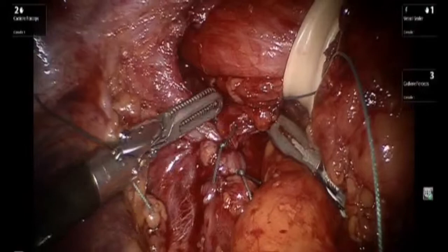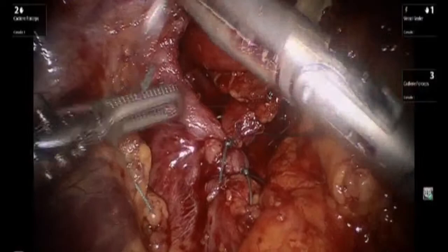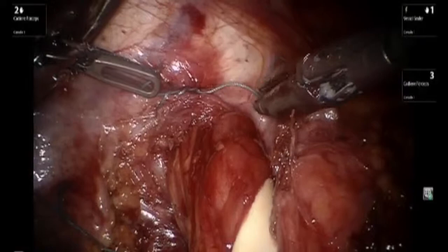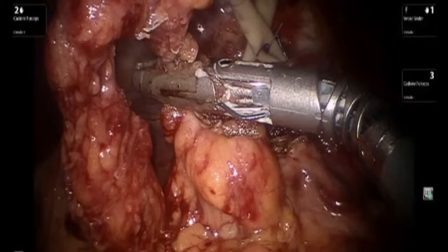It is important to pay attention so that the esophagus is not impinged, and usually one leaves space enough for a 5mm instrument to fit next to the esophagus in order to reduce the chance of dysphagia postoperatively. Sometimes one also needs to put anterior stitches for an anterior cruroplasty. The hernia sac is mobilized and freed up completely such that it doesn't interfere with the fundoplication.